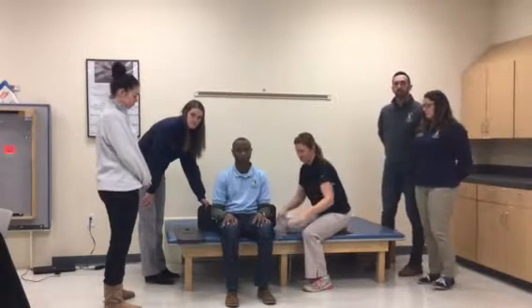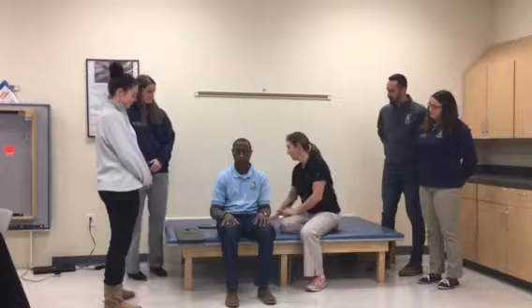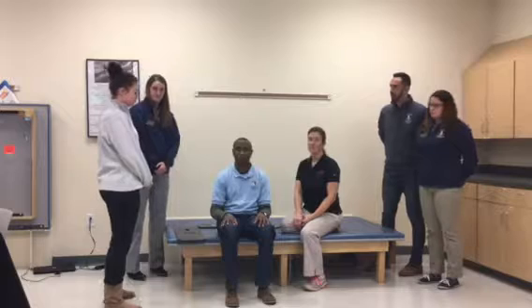So we know that his width would necessitate a 16-inch chair, and then for the depth we would take, what was it again? 24. We would take the 24 inches that Dixon measures, subtract 2.5, so then we would get 21.5 inches. Good job, Tamara. 21.5 inches, and then we would actually add the thickness of a back cushion if it's needed. We would not need one, so we would know that his chair could measure 16 by 22, because 21.5 would be a specific measurement, so we would go up a little bit. Okay? All right, and that's the first 2 steps of how to measure someone for a wheelchair.